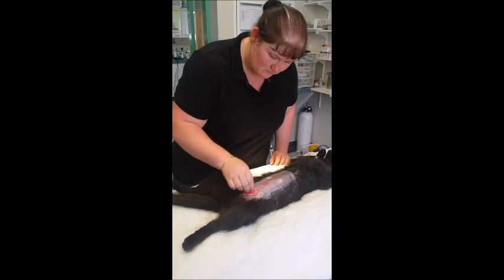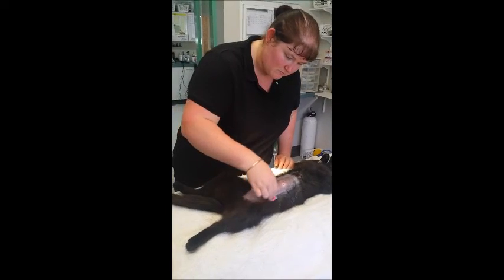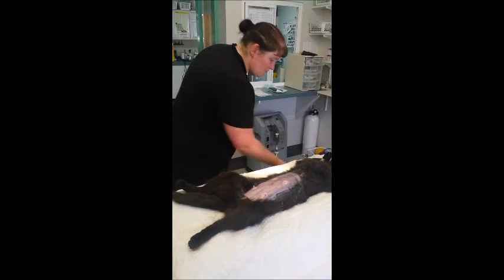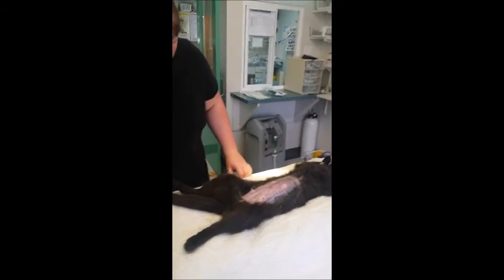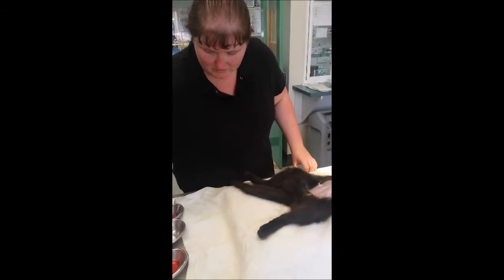The third and final scrub solution we use is 8% Chlorhex solution, 12% water, and 80% metho. This is the final scrub solution and we leave it on the skin, ready for the surgeon to drape the patient.